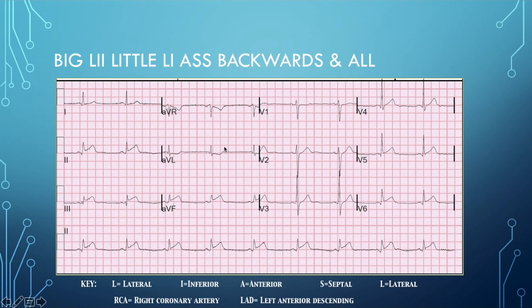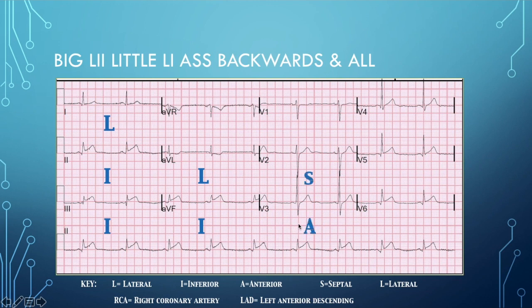Here's an example 12-lead. We'll start with leads 1, 2, and 3. We'll skip AVR, then go to AVL and AVF. Then we'll build the rest with V3 to V1 — ass backwards — starting at V3 and working our way up to V1, and then V4 through V6, which is 'all.'